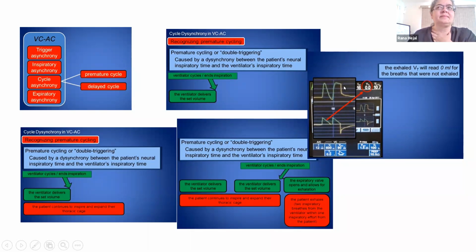Are they inhaling, exhaling, using muscles, not using muscles, assuming all of them are not paralyzed? Anybody? Inhaling and using muscles. Excellent. So they are really active. This activity will tell you that most likely this is double triggering, and you just work on inspiratory time or adjusting flow.